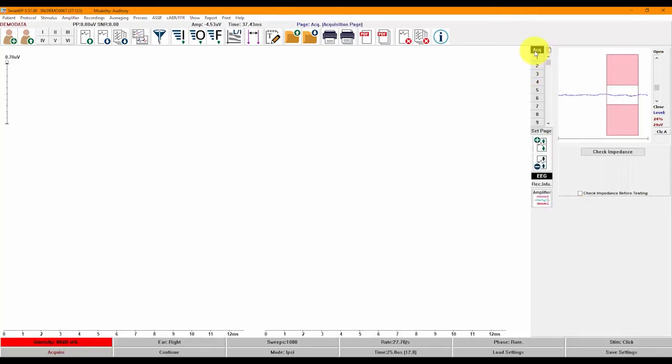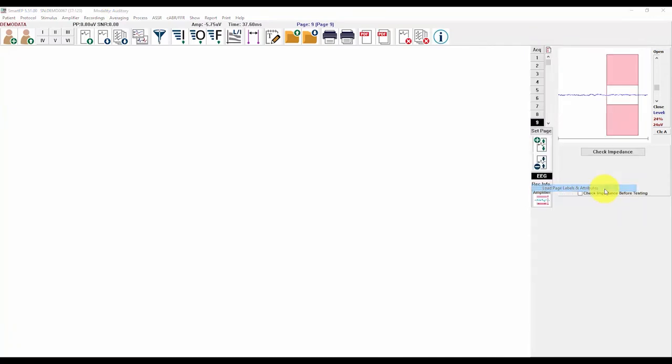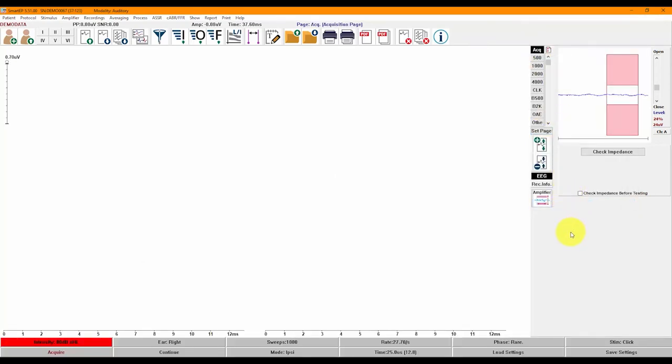The ACQ page is the Acquisition page, from which you will always be recording. The page settings for the Acquisition page are saved in the settings files, including the sample settings we provide. We provide a set of Pediatric Audiology page labels which can be loaded and saved as your default. Once loaded, you will notice that the page names have changed. We will talk about the other pages when we discuss report generation later in the video.